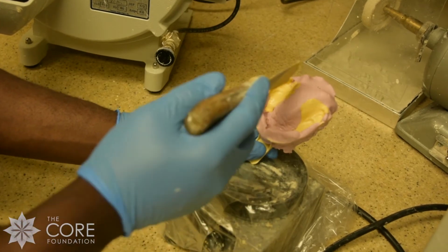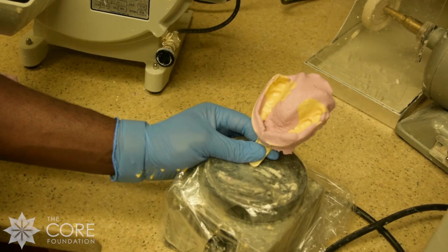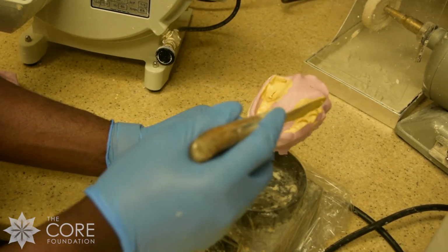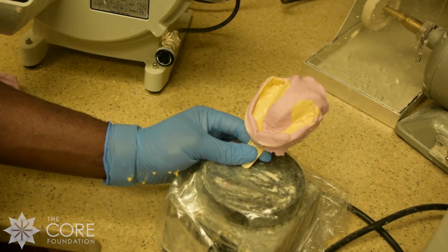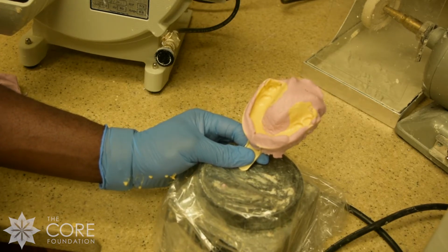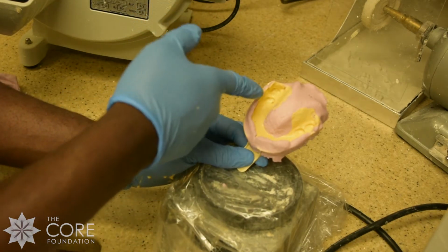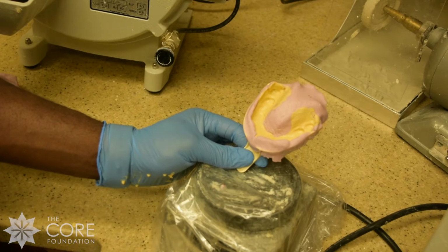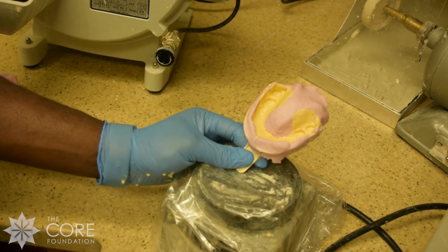You want to make sure you start off slowly. That way, if there's any bubble, it's filling it up and it's catching it before you continue. So we'll keep adding to it. And now we have it all in. There's a tiny bubble in here, so I'm going to wait for it to slowly mesh in with all the other ones. Okay, so that part is completed.